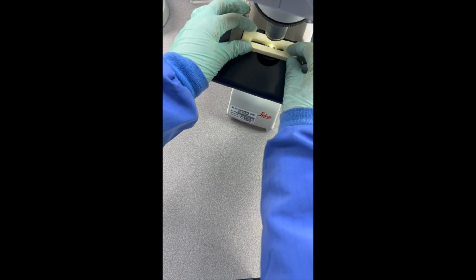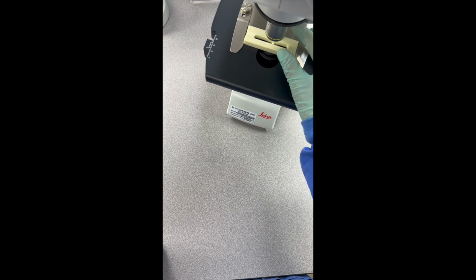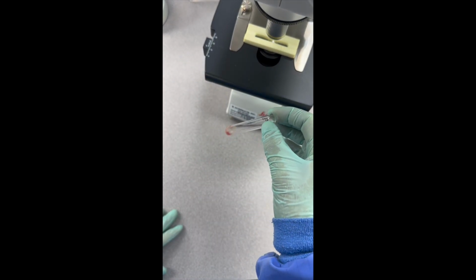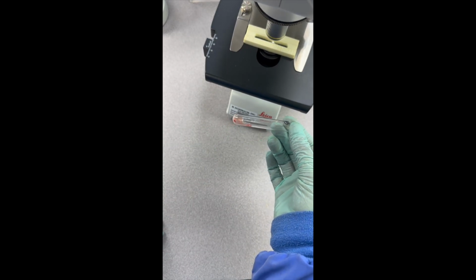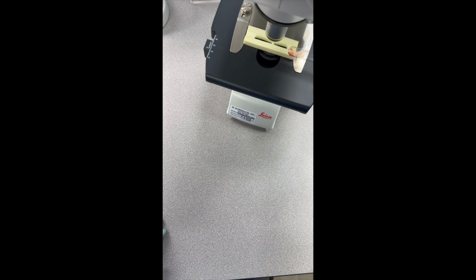Okay, so to view these rosettes under the microscope, we have this nice little holder here. This holds the tube, and I'm going to show you how I've typically done these in the past. So you take your tube here, and you gently want to resuspend this. And you want to do this really gently because you don't want to break up any rosettes that might be there. So we're going to suspend some of our specimen there, and then we're going to put it on this holder here.